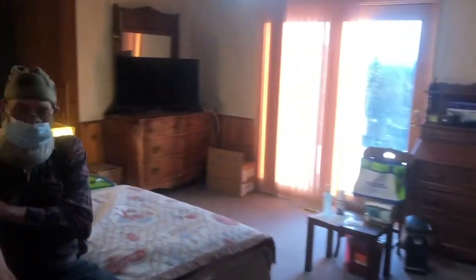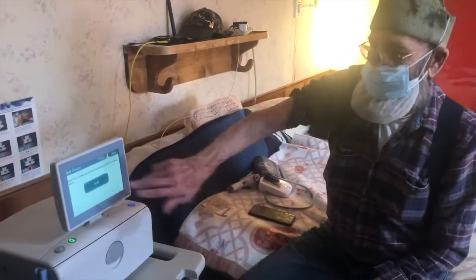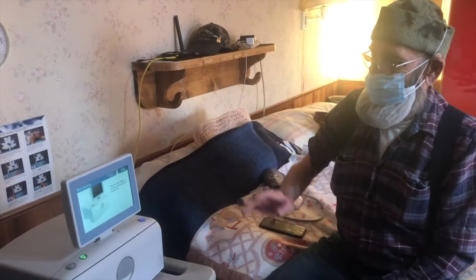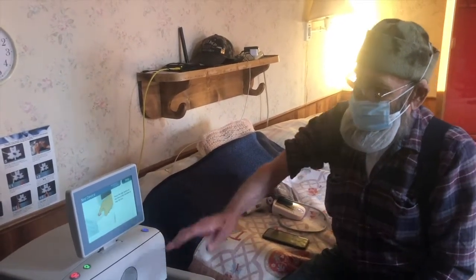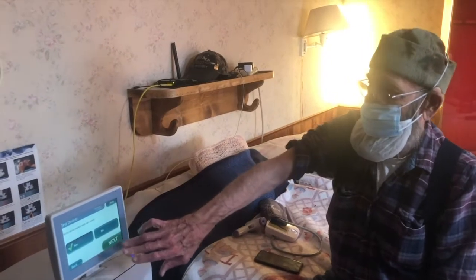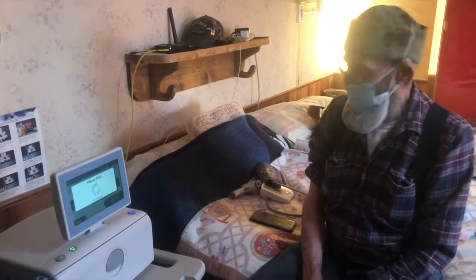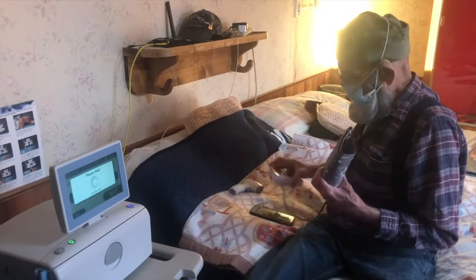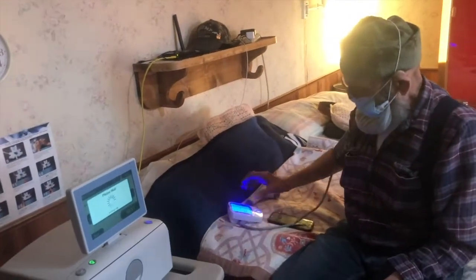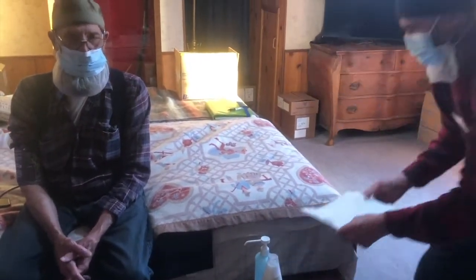And our machine's ready to start its testing stuff here. We do everything this machine tells you. It tells you every step to take, and this is a normal situation here, and it happens every night. Yes, it did alert me to that. So then I do my next. And then while I'm waiting on that to do its thing, I do my blood pressure. My assistant Pete gets everything else ready.